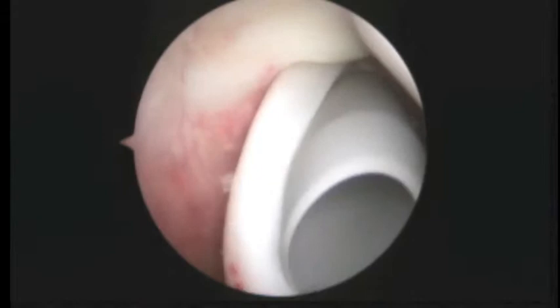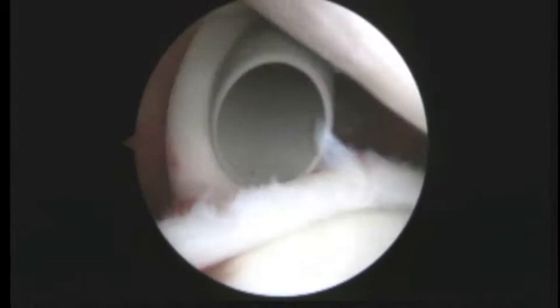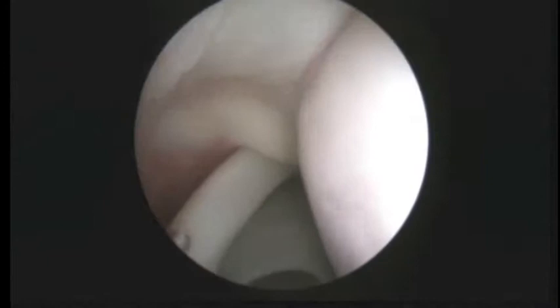Here we are looking at the biceps tendon on the left side of the screen. Running up — the biceps tendon is fine. It's this area here that we're concerned about, and so we're going to do a SLAP repair there. Your rotator cuff here above looks fine.